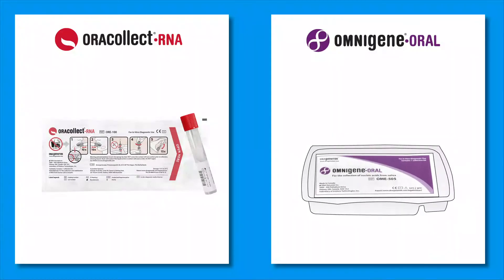Collection using OMNIgene ORAL involves providing one milliliter of saliva into a tube. In this tube, the preservative chemistry is sealed within the funnel.